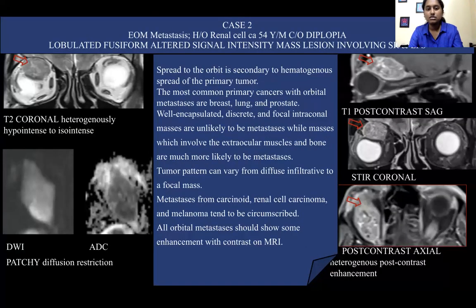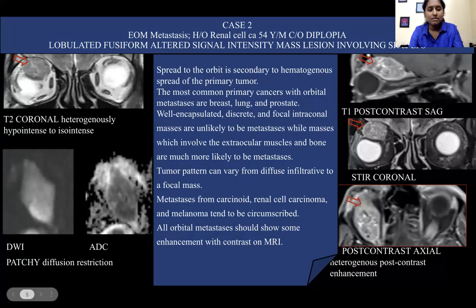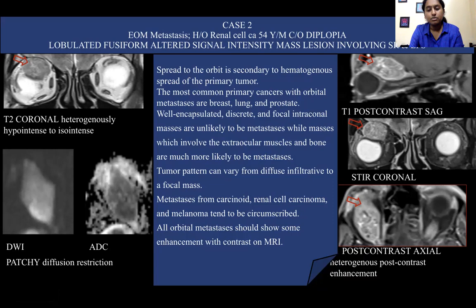My next case was a 54-year-old male with a history of renal cell carcinoma who came with complaints of diplopia. MR imaging demonstrated a lobulated fusiform altered signal intensity mass lesion involving the superior rectus and the levator palpebrae superioris. On T2 coronal images, there is a heterogeneously hypo- to iso-intense mass showing some patchy diffusion restriction as well as heterogeneous post-contrast enhancement. This was later proven to be a case of extraocular muscle metastasis.